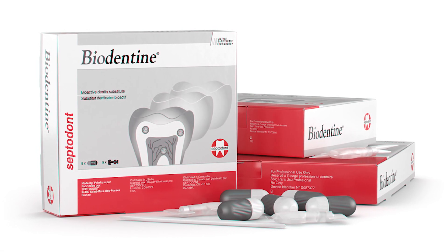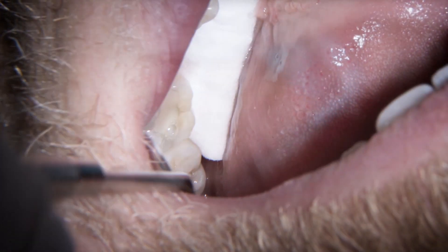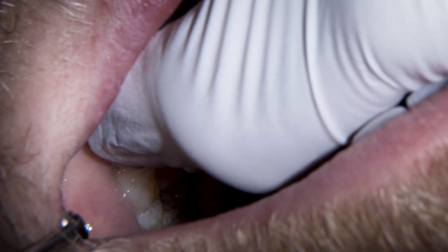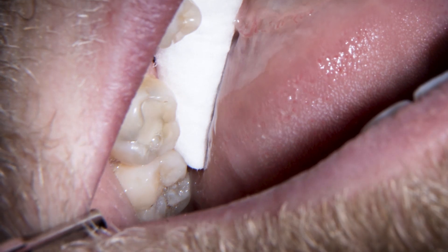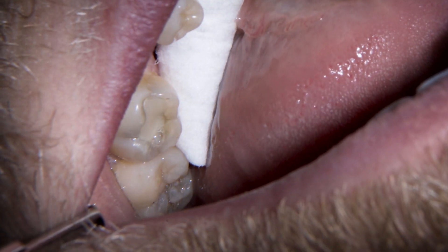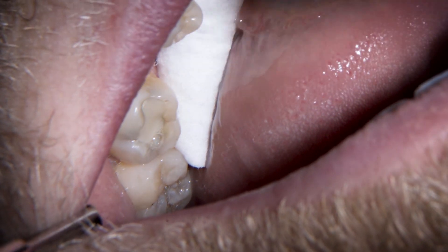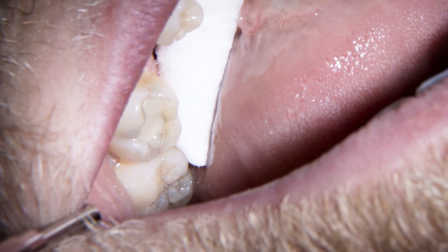Enjoy watching and I hope you find it informative and useful. So we've got a composite that we're replacing here. We can see some grey shadowing all around the margins and spreading into some fracture lines, mesially and buccally, and then we're seeing the same on the bite wing — an area underneath the filling — so we're going to run that out. It's deep enough to warrant putting biodentine in there and then we'll replace the fill, probably running these fracture lines out a little bit.